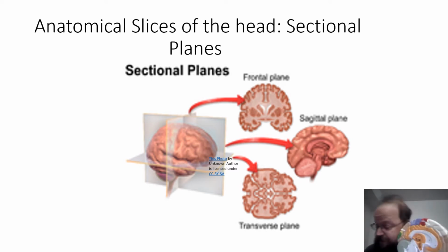And there are specialized software packages that allow you to, in effect, rotate it. And so you can look in different areas of the brain as a physician or as the radiologist. You can look at it and say, all right, there's swelling in this area, there's a tumor, and you can even extract a tumor electronically and rotate it and look just at that object.